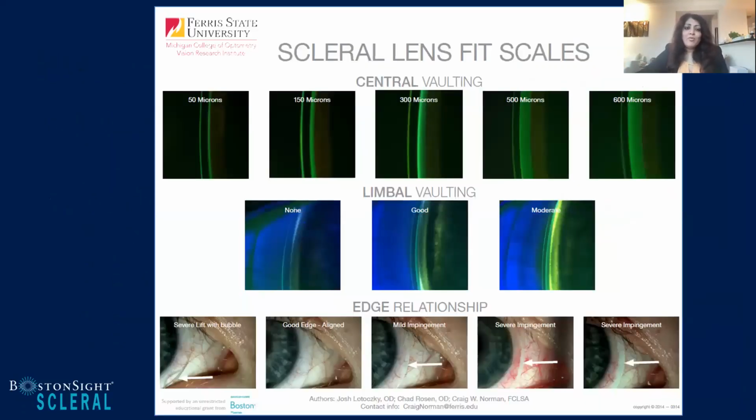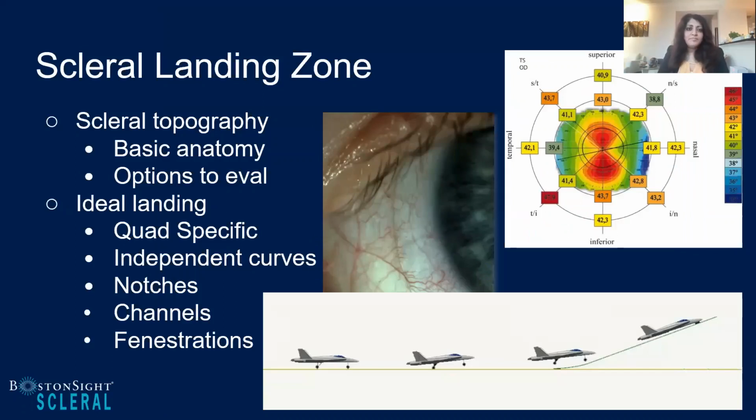And one of the last things just to mention is that your patients are really key when you're evaluating the landing zone, because before I even look at the landing zone, whether it's with the OCT or the slit lamp, I'm asking our patients, how do they feel? What do they feel? Because they're going to guide us to areas where that lens is lifting and where the edge is lifting. And that really helps you hone in on areas that you need to take a closer look at.